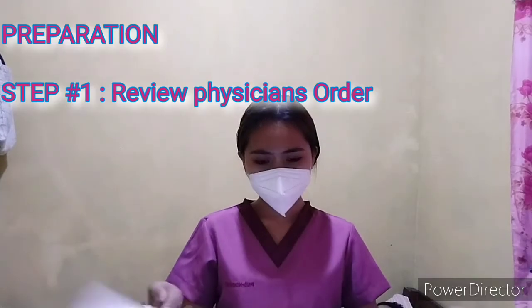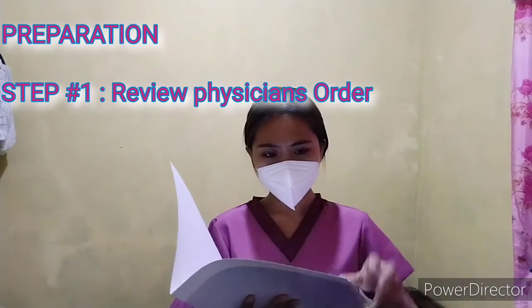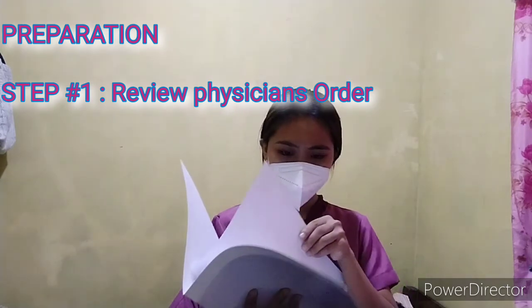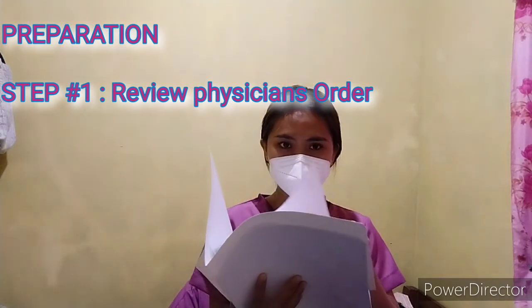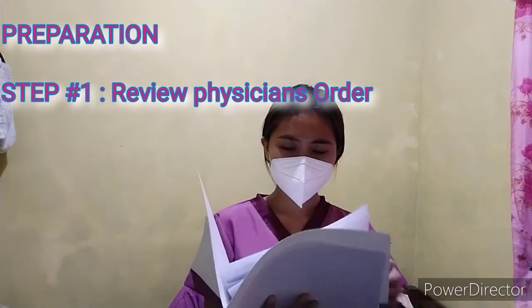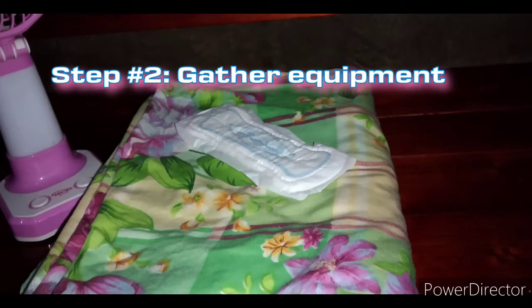So for our preparation, we have step number 1, review physician's order to determine treatment area, type of application, and length of time. Rationale: proper treatment applied at the right area facilitates a faster and more effective healing process. For step number 2 in preparation, gather equipment and check it for safety factors to ensure an orderly procedure.